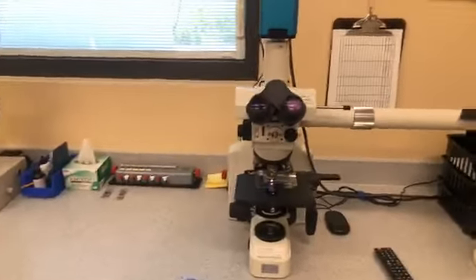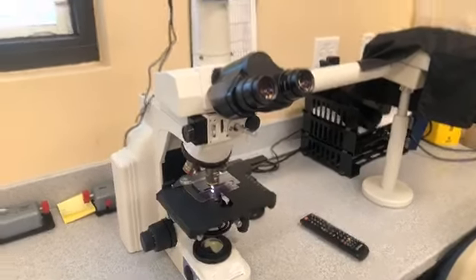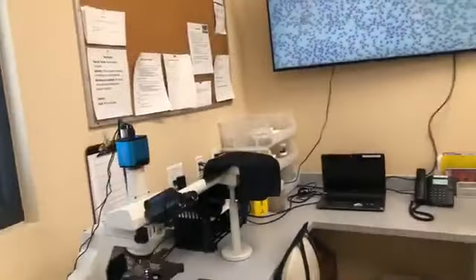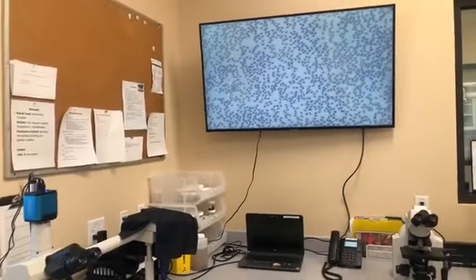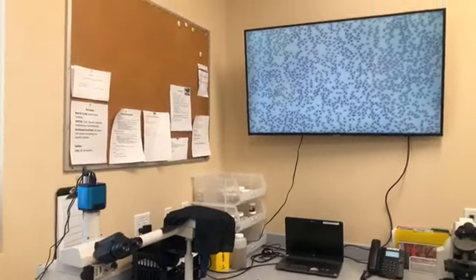And then this is a white blood cell. There's not a whole lot on this slide. And then they have platelets, just like mammals too. So we have to know the variances between birds, reptiles, mammals, fish, amphibians, and even between each species. So like a flamingo versus a pheasant versus a penguin, they can all be very different from each other.